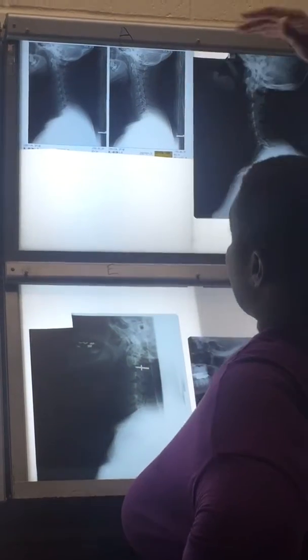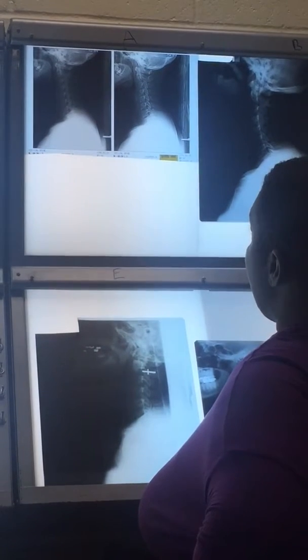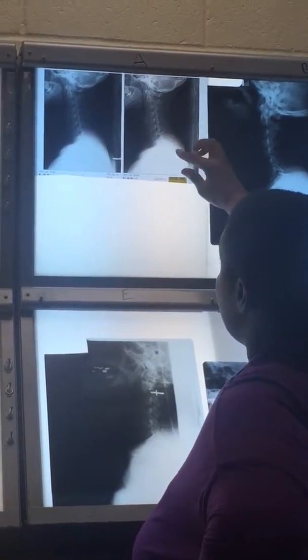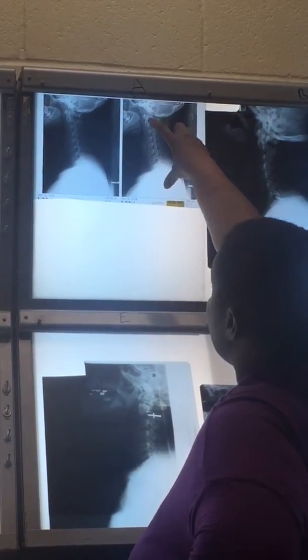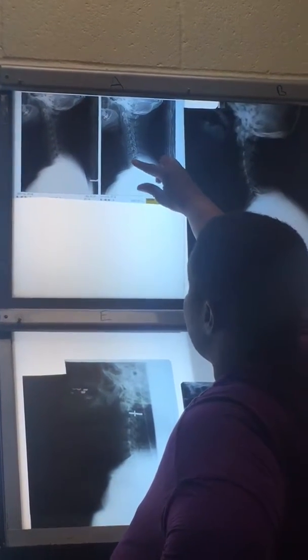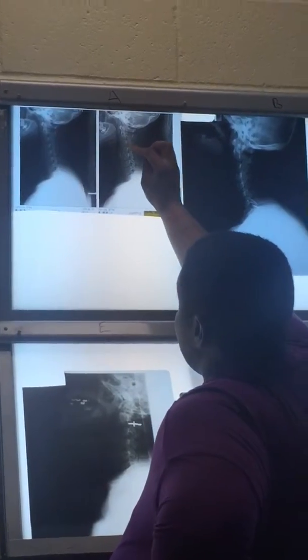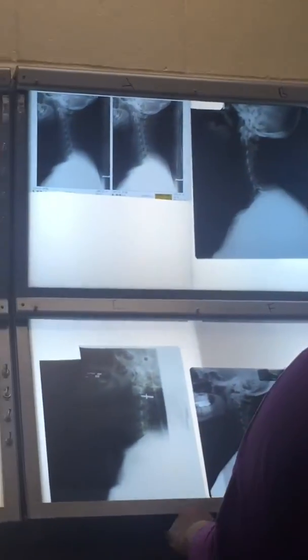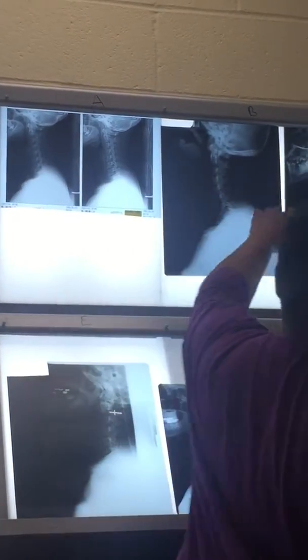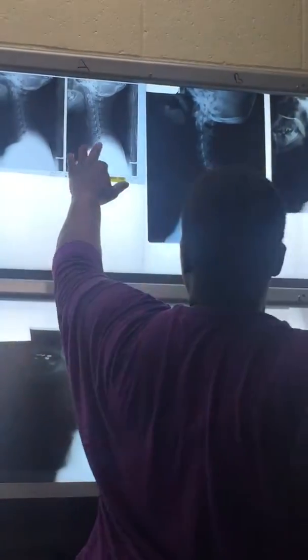And then once you have answered that question, you move to your evaluation criteria, and then identify anatomy. Key things: definitely know which spinous process is which. Also know which vertebral body is which, as well as which intervertebral disc space is which. The little slant line is the main thing they're looking at on this x-ray. That little slant line is the zygapophyseal joint. I will have the number, probably the same number.